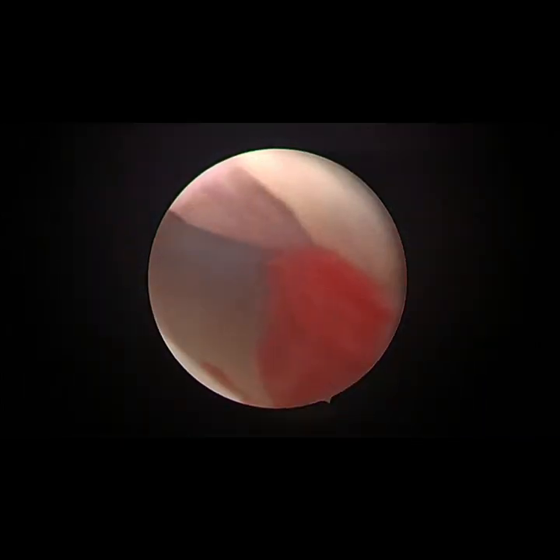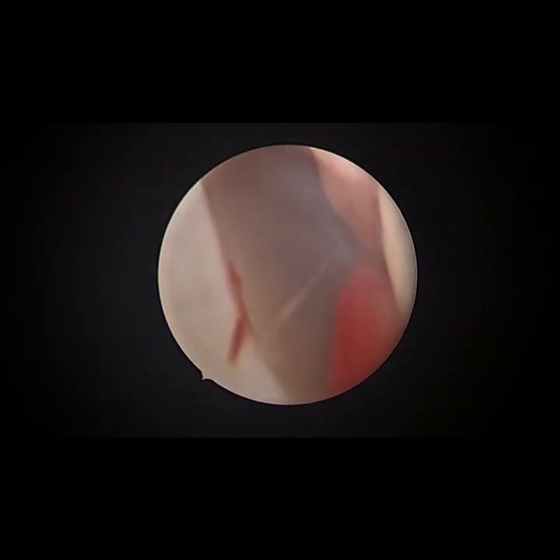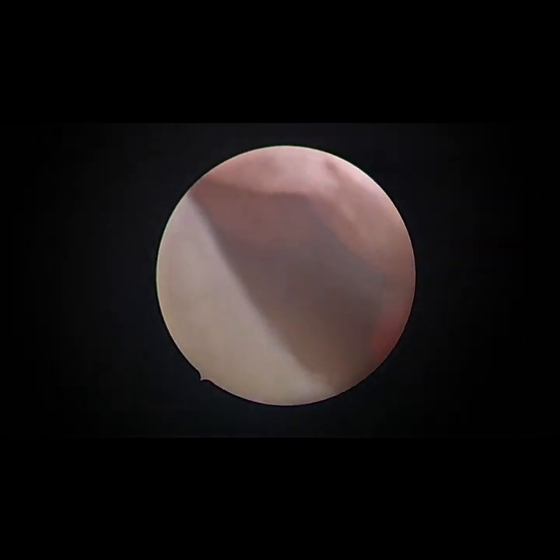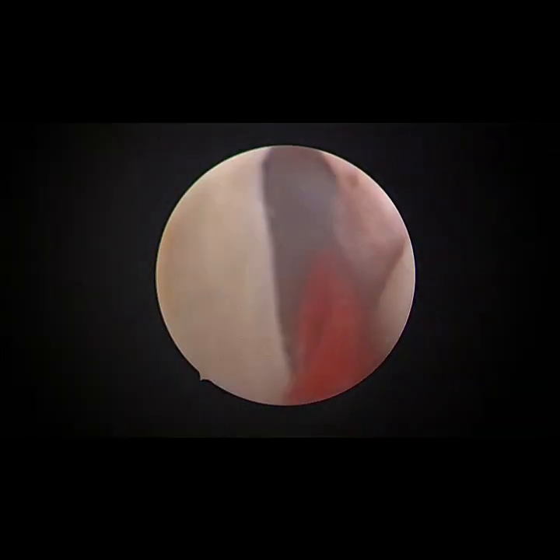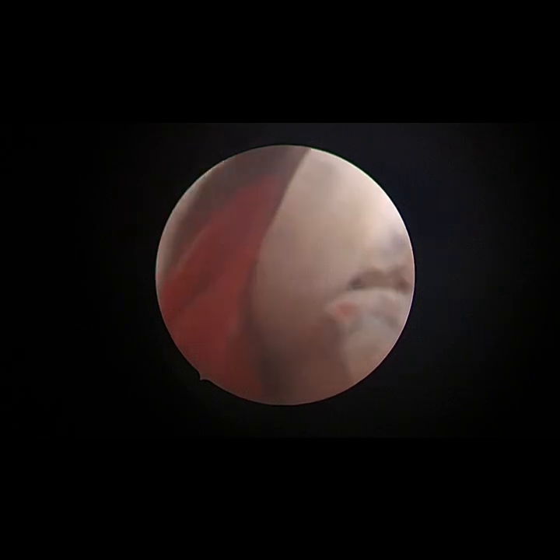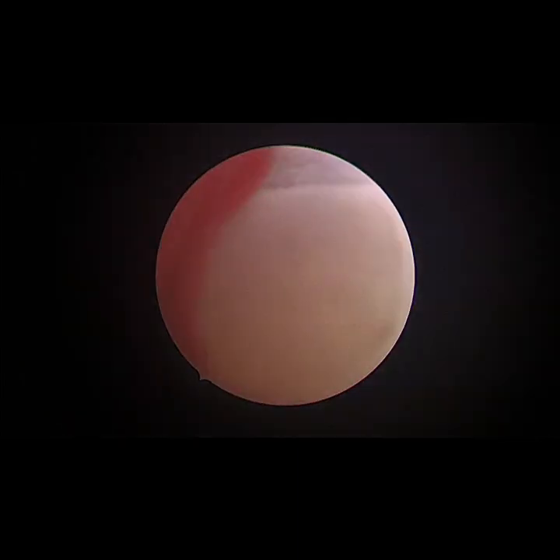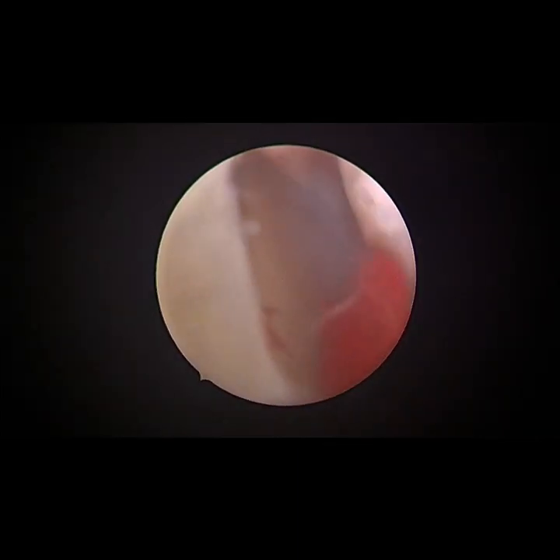degenerative femoral head, acetabular labrum and thick synovial folds. The whole joint is examined and lavaged and checked for any loose bodies or loose pieces of labrum. As we are viewing from the anterior portal, we can see the anterior structures of the hip joint.